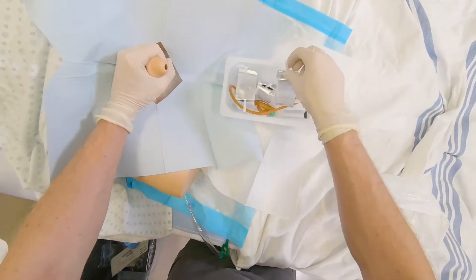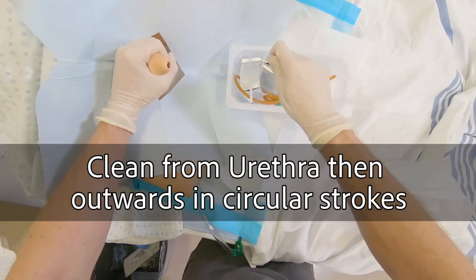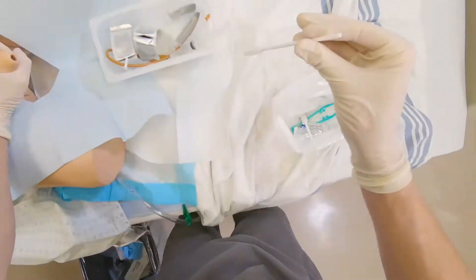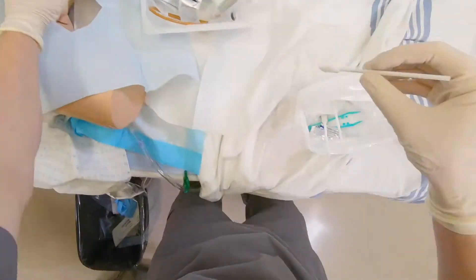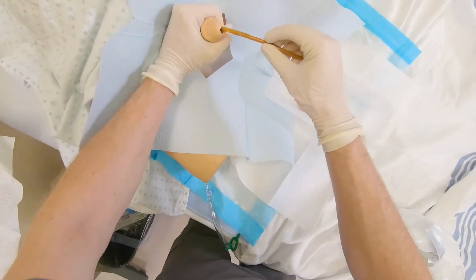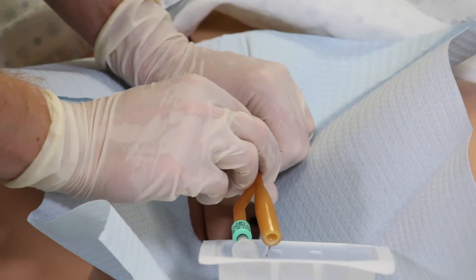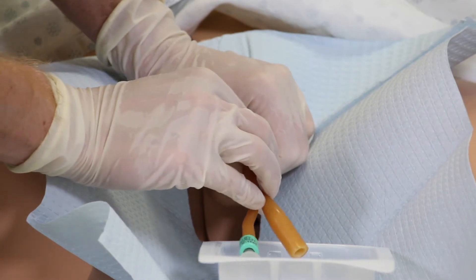Gently grasp penis with non-dominant hand and use freehand to clean from urethra then outwards in circular strokes. Hold the penis at a 90 degree angle to the patient's body and slowly insert the catheter into the urethra. Insert until urine flows and then advance another couple centimeters.